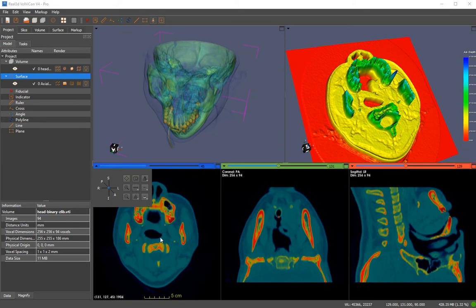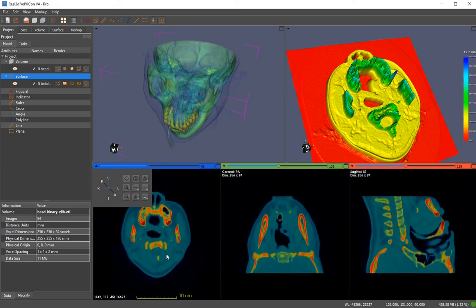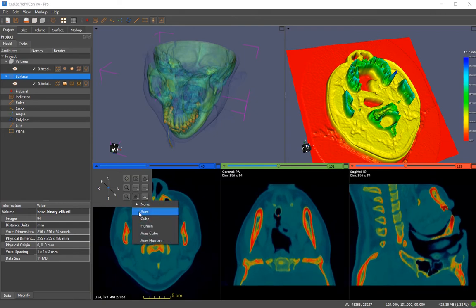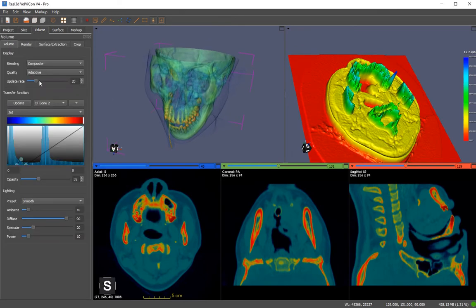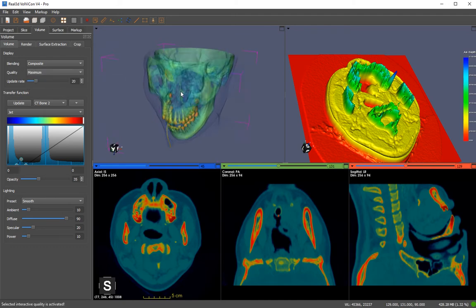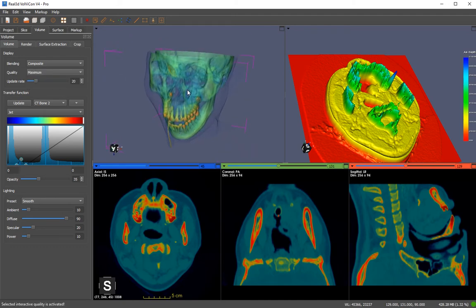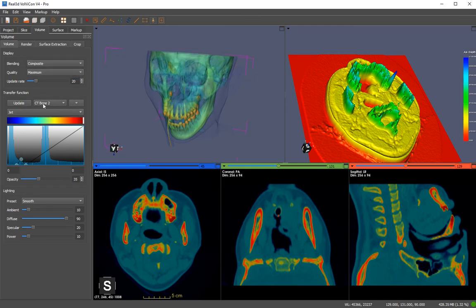You can enable scene origin axis and a distance ruler — the ruler is only available in parallel projection, so it automatically switches from perspective projection. Now let's move to the volume module. You have options for volume manipulation: you can change the blending option and set quality based on your graphics card capability. With a high-performance graphics card you can set it to maximum so volume data won't be resampled while interacting with the mouse.